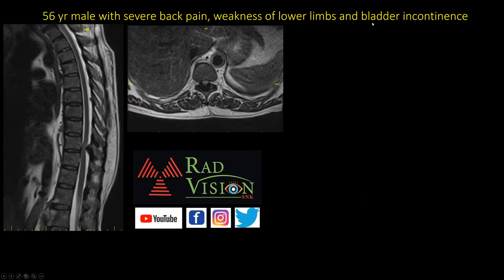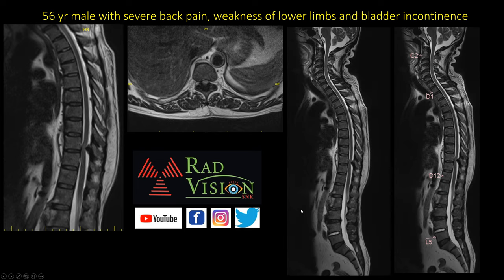Next case: 56-year-old male with severe back pain, weakness of lower limbs, and bladder incontinence. There is significant ligamentum flavum thickening causing compression of the thecal sac and spinal canal narrowing, with T2 hyperintensities in the spinal cord at that level, suggestive of cord edema or compressive myelopathy. While ligamentum flavum thickening is seen at multiple levels, the teaching point is that it most commonly occurs at the T10-T11 level in the thoracic region.